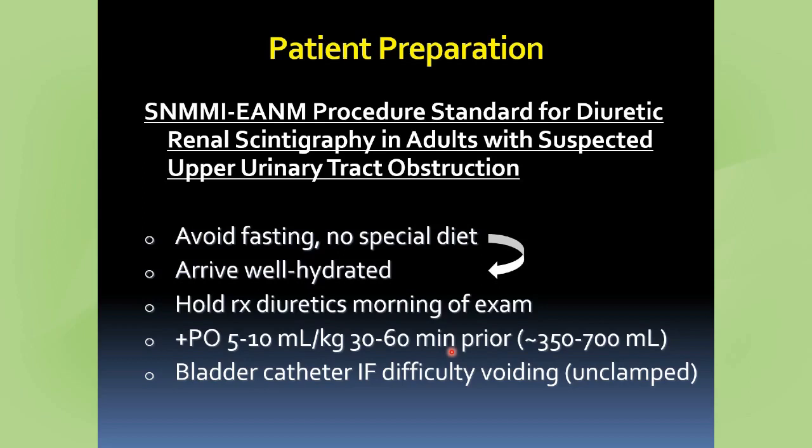So you can see there, they say avoid fasting, no special diet, arrive well hydrated. But on top of that, they go a little bit deeper. They recommend holding your diuretics the morning of the exam. So if the patient is on chronic diuretics, you want to hold those, for the same reason as you want them well hydrated. Even if they've hydrated, you don't want them to have urinated that out a lot before they come to your clinic.